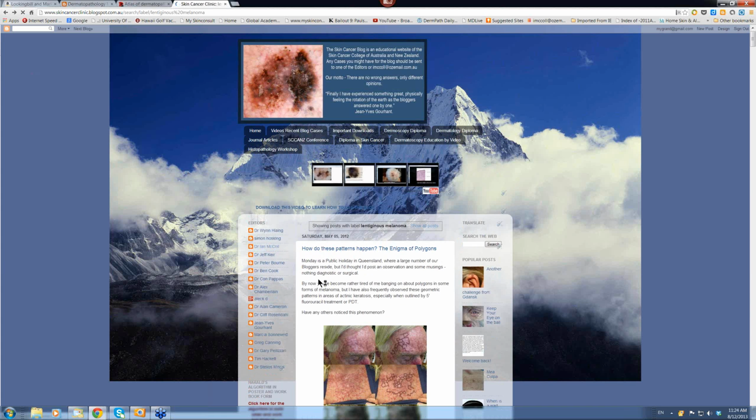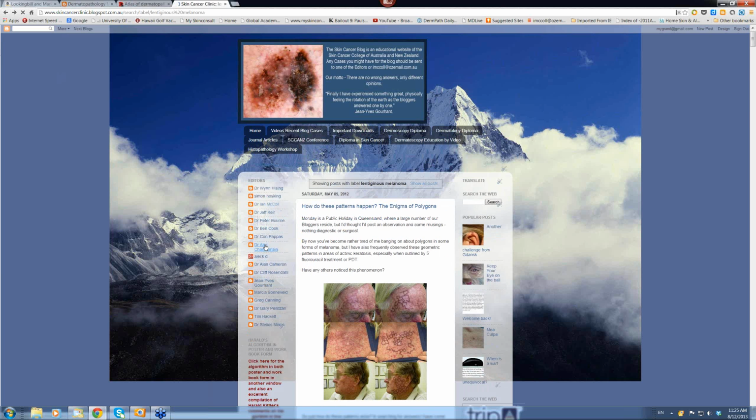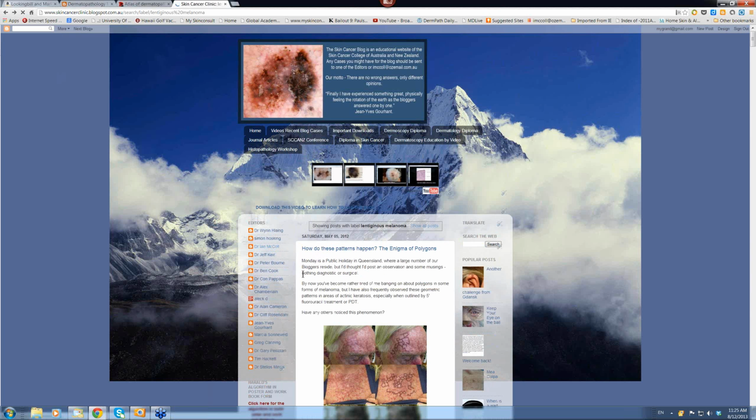Let's have a look at this, a couple of monitored views that Jeff did. I think they're about 3 months or so apart. Again, there were polygons in this original one anyway. This was the second one where perhaps the polygons are a bit more. These are very slowly evolving lesions. You know, some people argue that nothing much might happen with these. They may well remain like this for years and years and just slowly evolve in this way. But we're still not sure if that's the case or not. I think they are certainly slowly evolving melanomas.